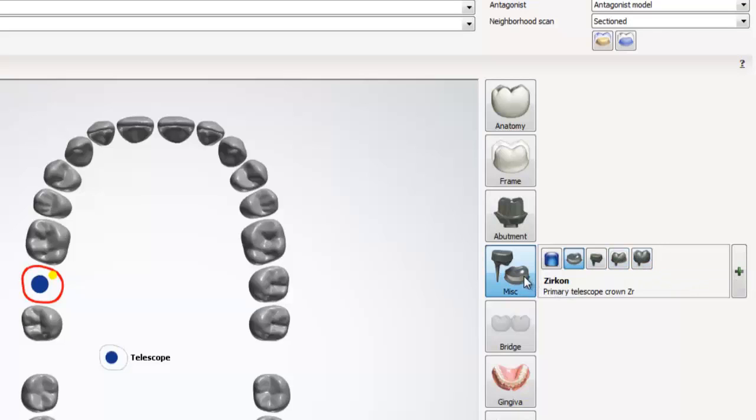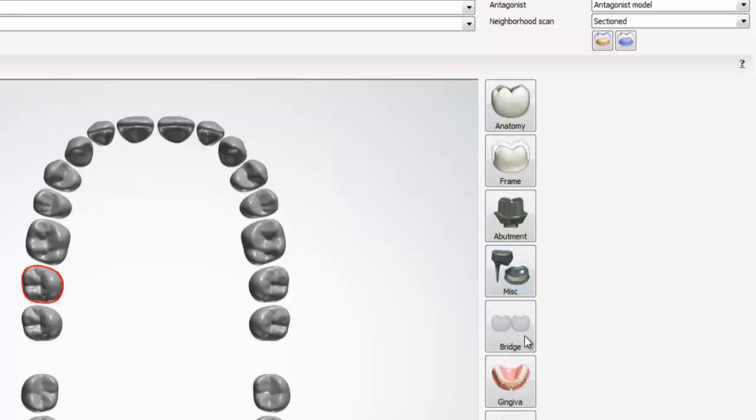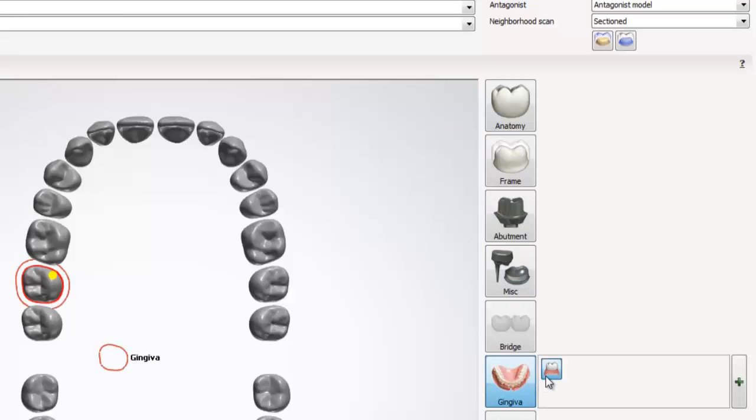Directly under miscellaneous is the bridge option, which we will use to bridge teeth together. I will cover this in a later tutorial. Below bridge is gingiva, which allows you to add gingiva to your design.